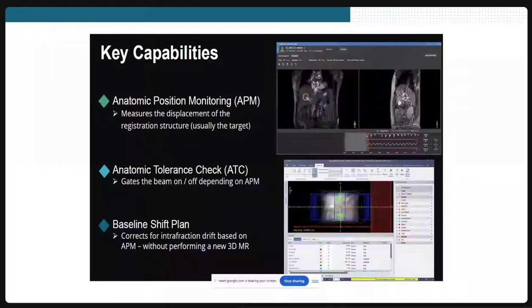If the fiducials are kept in the wrong position, you track the wrong area. Not only that, suppose we assume the fiducials are kept in the tumor, how about the critical structures? Suppose you want to see how much of a critical structure is coming into the tumor on a particular day. It is impossible to see in a CyberKnife because they don't have a CBCT.